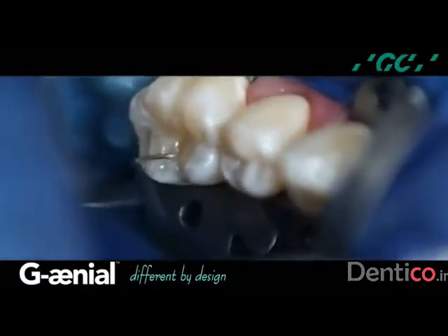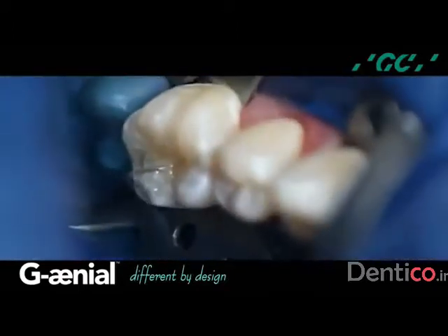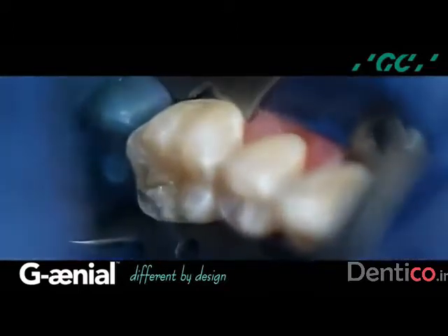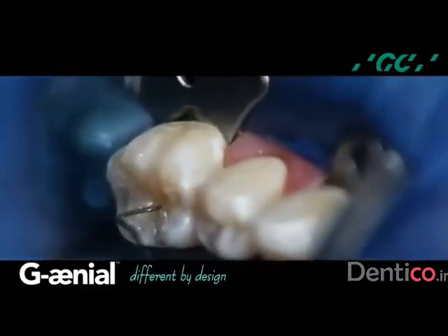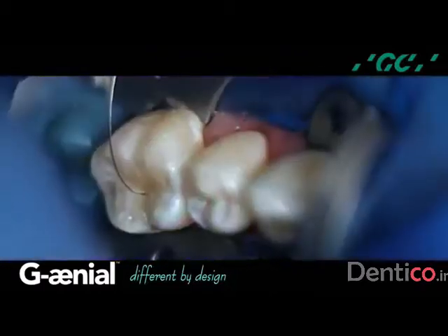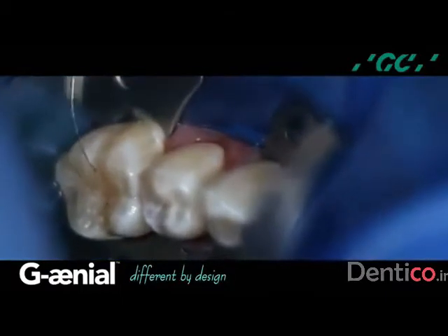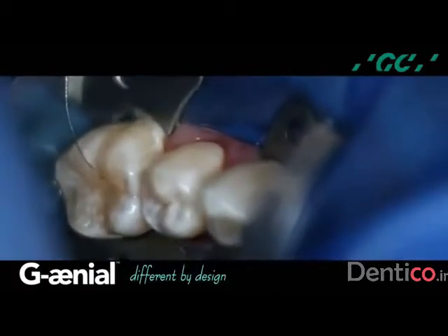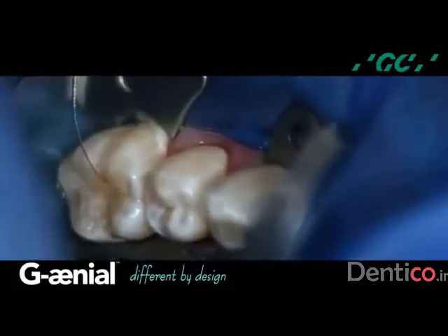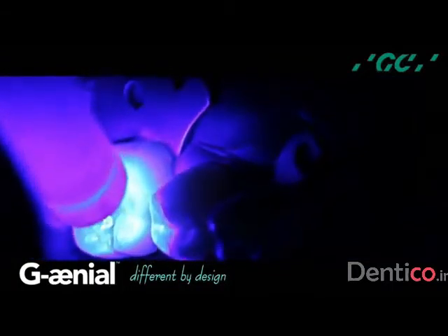I continue to develop the ridges and planes with an A2 shaded flowable as my final dentin layer, developing the anatomical morphological characteristics, the planes, the ridges and grooves, and light cure for 10 seconds. I use an ochre tinted color modifier, placing it with an 08 endodontic file to create occlusal fissure staining, a very natural effect within the final dentin layer, and light cure for 40 seconds to stabilize the color.